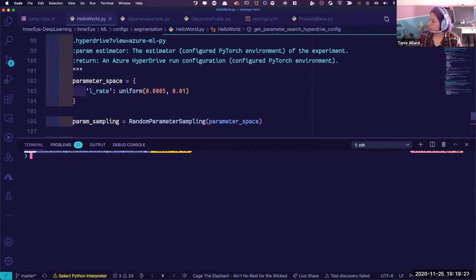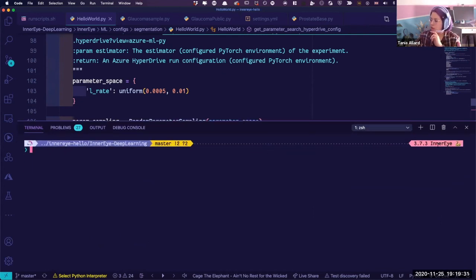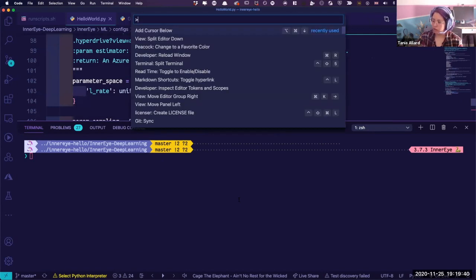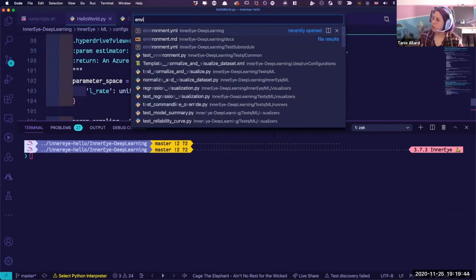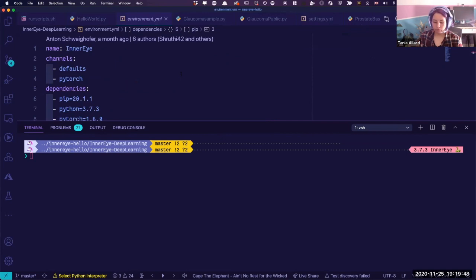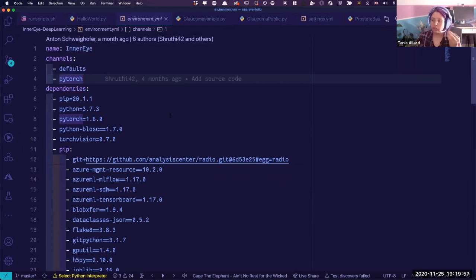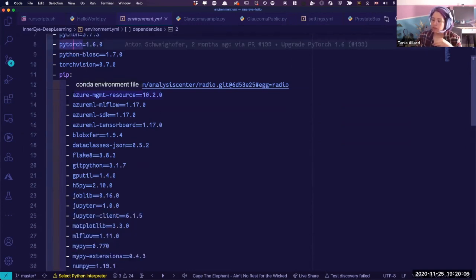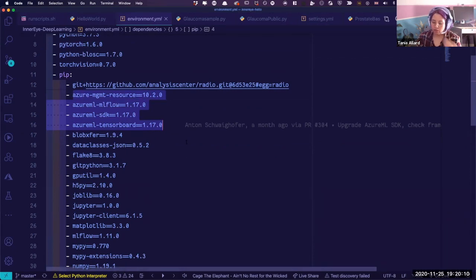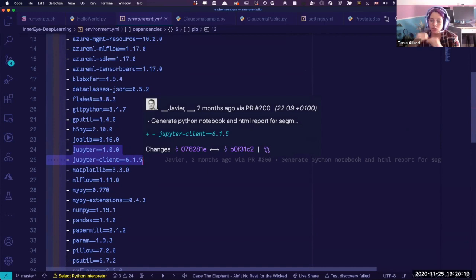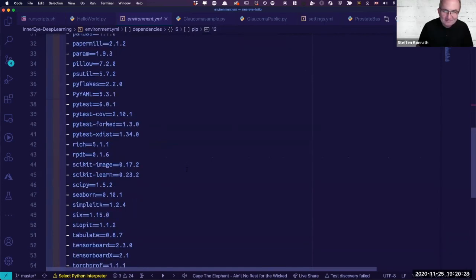I'm using a conda environment that I've already set up. We already provide an environment YAML file in InnerEye and you can use that as a base, adding any other Python libraries you need. It already contains PyTorch and all the different SDKs so you can start interacting with Azure Machine Learning. We also use Jupyter because after training is done, it creates a Jupyter notebook providing a report of your model training, along with an HTML version.